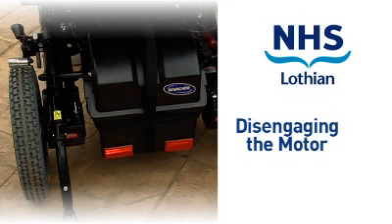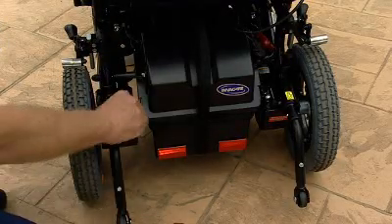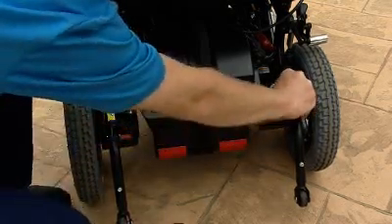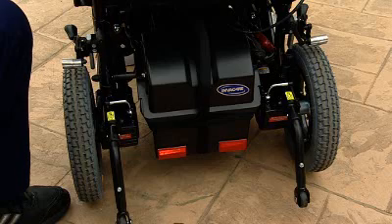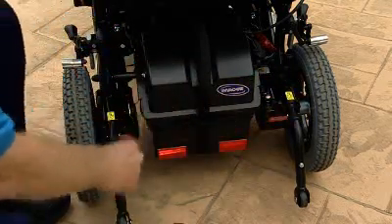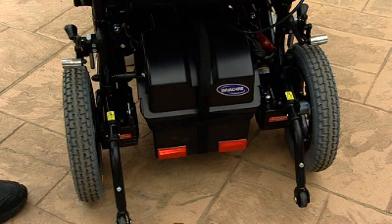Disengaging the motor. To disengage the motor from the wheels, turn both handles so they are pointing outwards. This will disengage the motor and will allow the wheels to move freely. To re-engage the motor, turn the handles so they are facing backwards. The handles may vary on different models of powered wheelchairs.